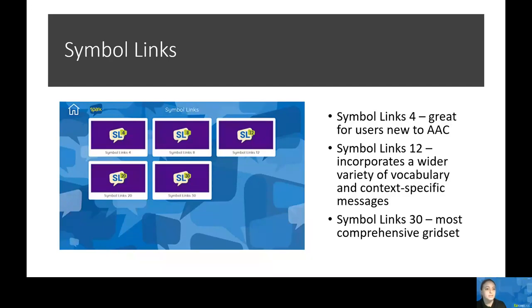With Symbol Links 8, this features eight cells per page and supports language functions including making requests, providing personal information, greeting others, and asking questions. Moving to Symbol Links 12, this builds upon previous levels and incorporates an even wider variety of vocabulary categories and context-specific messages. Symbol Links 20 provides ongoing support for those learning to combine words into phrases, with categorically organized vocabulary, quick fire phrases right on the main page, and a keyboard for spelling and literacy support.